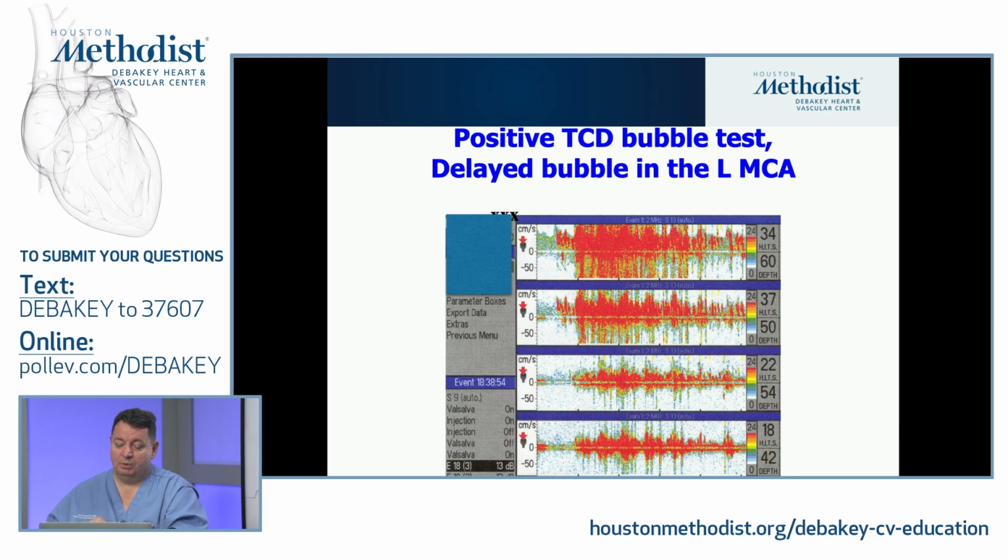And here's my other beautiful pitfall. So this is a young individual, and the bubbles on this side are delayed by 1 heartbeat. And you see the bubbles are a little bit less, the waveform less. So this is actually behind an ICA occlusion. This is how long it takes to get from one ICA to cross to the other side and get into the left MCA.